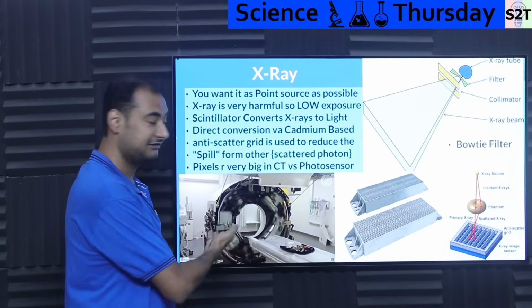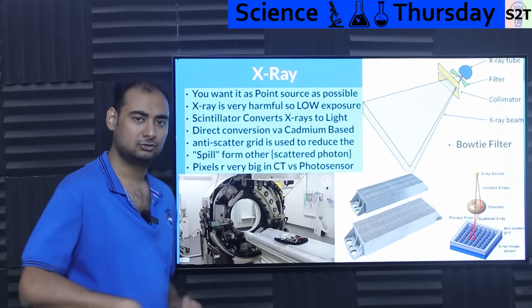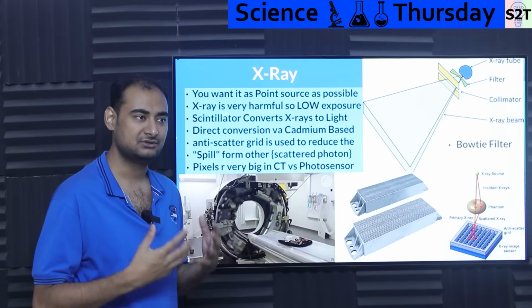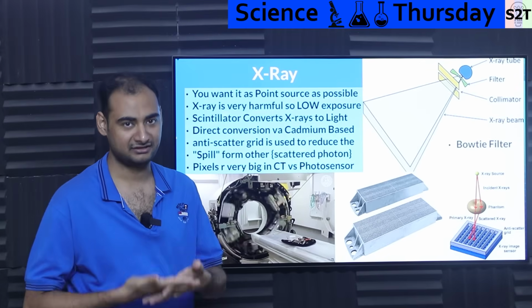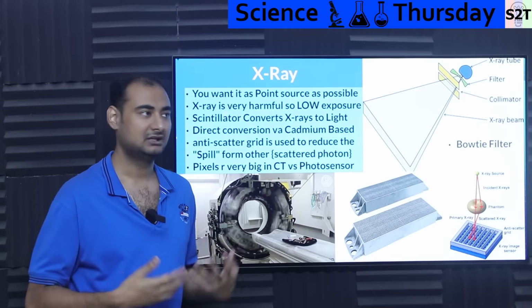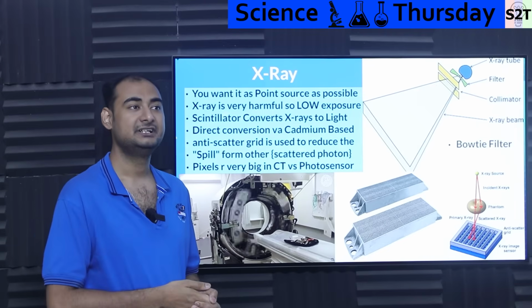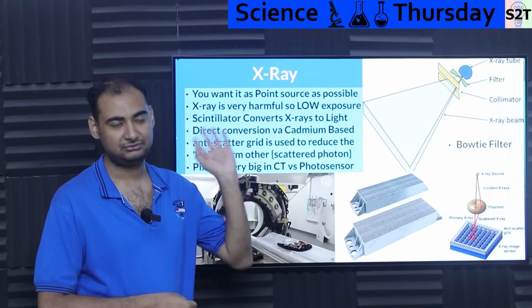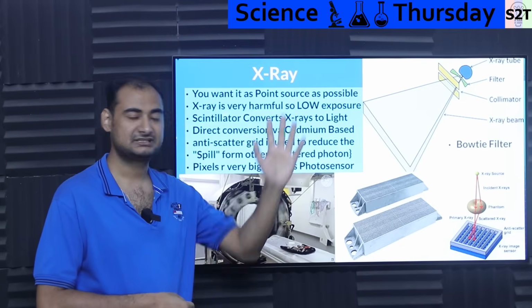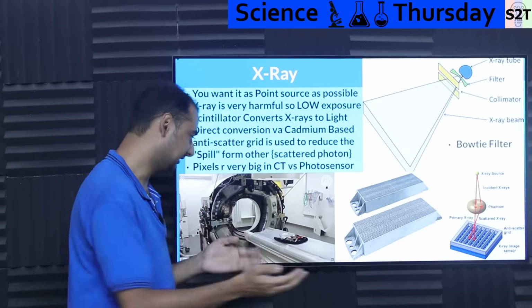Now, is it safe for people? Most people, yes, absolutely. And generally, people do not just go YOLO on CAT scans. Generally, you have an issue where, if it is left untreated, you are at much bigger risk. For example, if I have, let's say, a blood clot or a cancer that doctors cannot diagnose reliably enough, this minor dose exposure to me is like, yeah, this may cause some issue 70 years down the line. You will not live 70 years if you do not have this treated. So they're like, go into this.